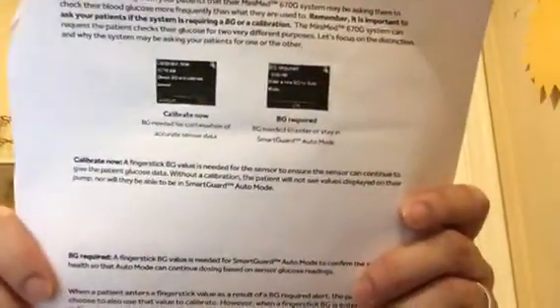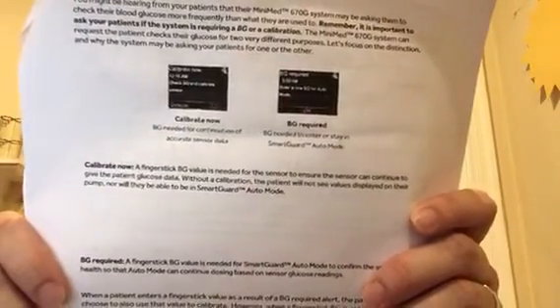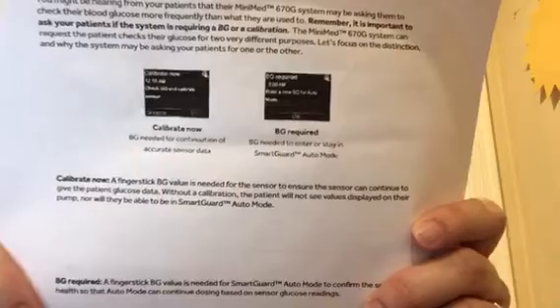The first one is 'Calibrate Now' and that says 'BG needed for continuation of accurate sensor data,' and then 'BG Required' which is 'BG needed to enter or stay in smart guard auto mode.' So 'Calibrate Now' — a finger stick BG value is needed for the sensor to continue giving the patient glucose data. Without a calibration the patient will not see values displayed on their pump, nor will they be able to be in smart guard auto mode. Basically, you've got to calibrate now or you get kicked out of auto mode and you don't have your number anymore.